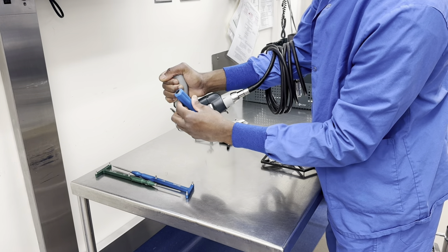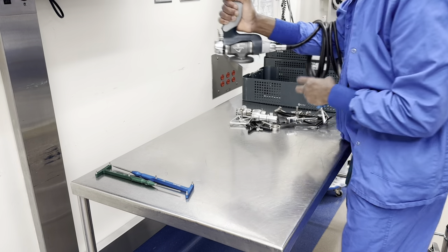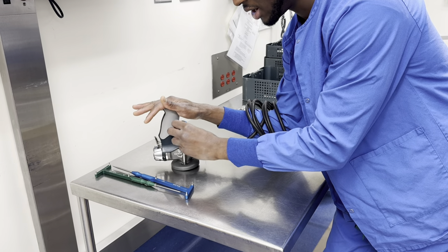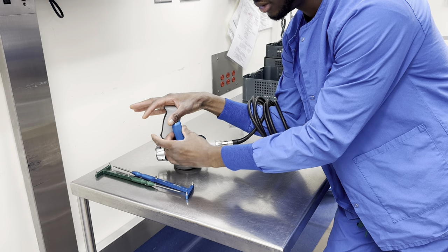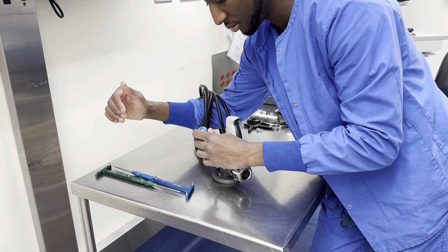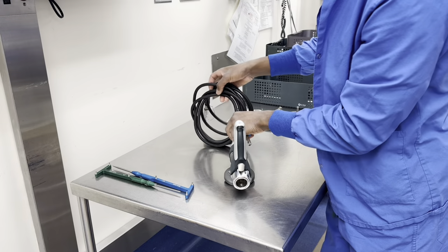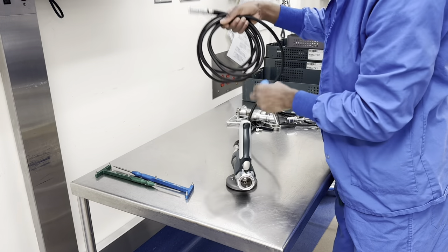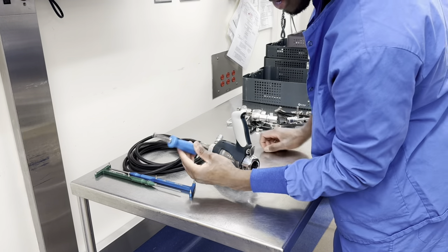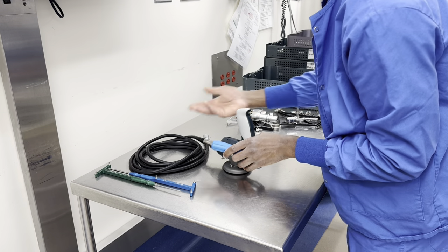The screwdriver handle helps twist the handpiece in. You walk it over to the robot, put it on, keep one hand on it, and screw it in quickly — then do the other side the same way. Give the end of the cord to your rep and they'll strap the handpiece onto the robot. At the end of the case, always have the screwdriver ready for your rep so they can take the handpiece off the robot and put it into your case cart.